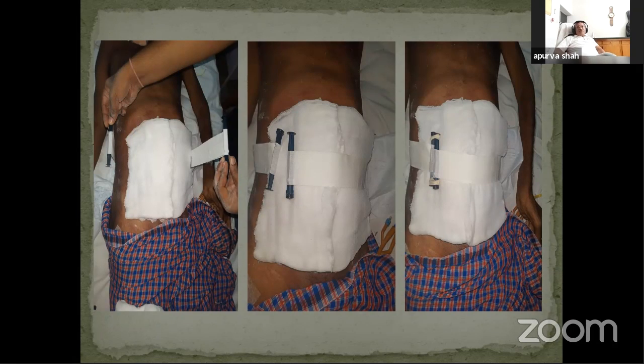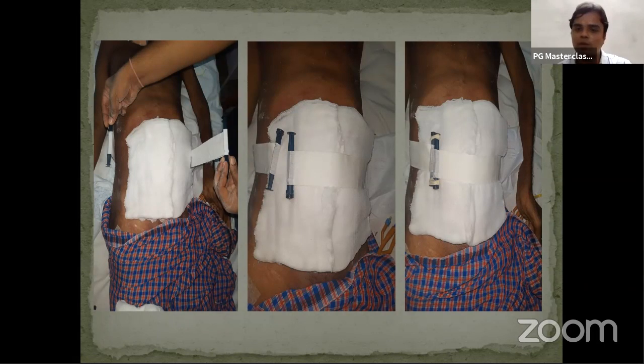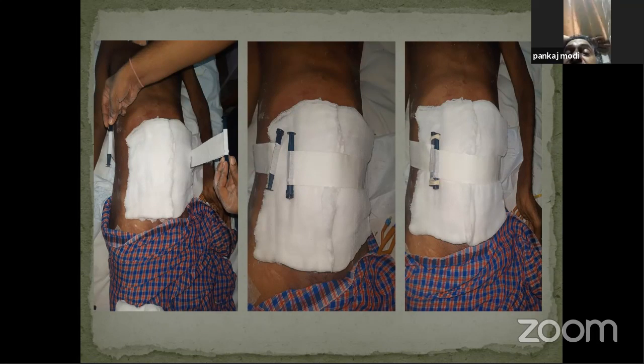But when a lot of fecal material is coming, especially from the terminal ileum or the jejunum, you cannot even apply the sticking plaster or the micropore, it will excoriate the skin more. So in those cases we use it, and the first layer should always be a Vaseline gauze piece so that it does not stick to the bowel. Again, here there can be one belt or two belts also. Yes, sir. The purpose depends upon the length of the wound. It can be one or two.